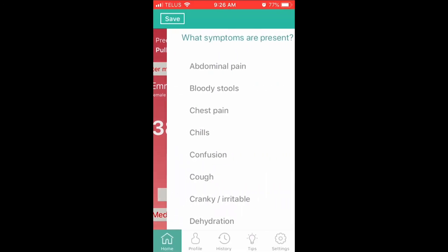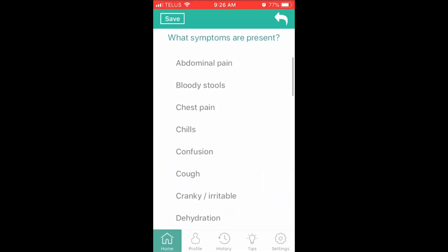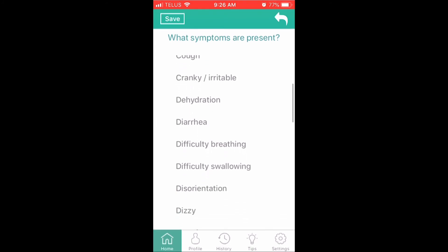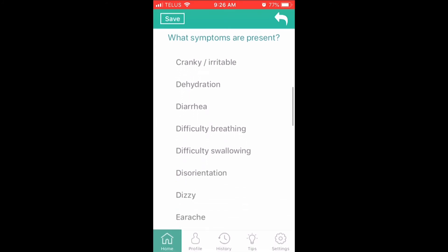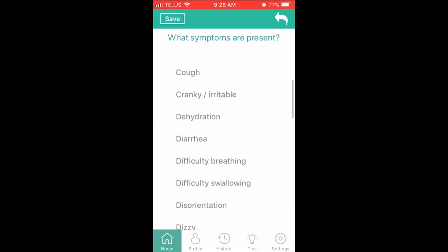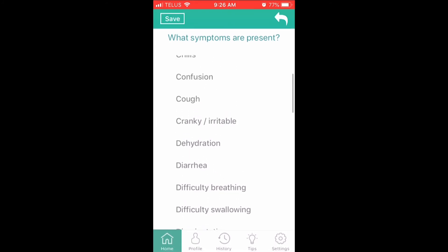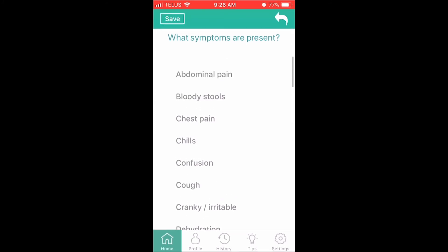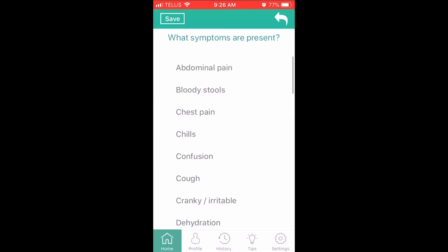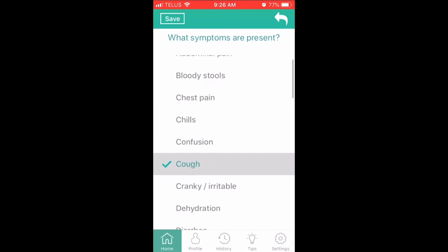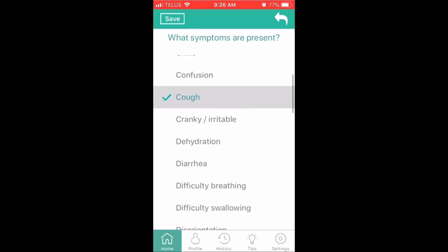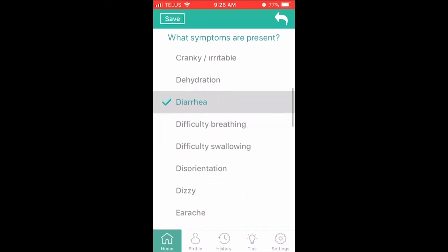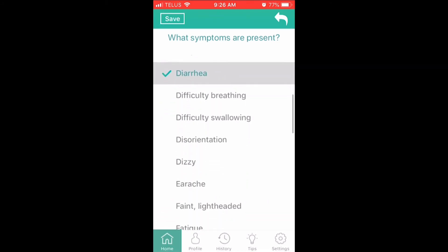To enter symptoms, press the Symptoms button on the screen. You can select as many symptoms as needed. When done, press the Save button. You can only add symptoms when there is a fever measurement on the screen. If the temperature is showing three dashes on the screen, you cannot enter any symptoms.